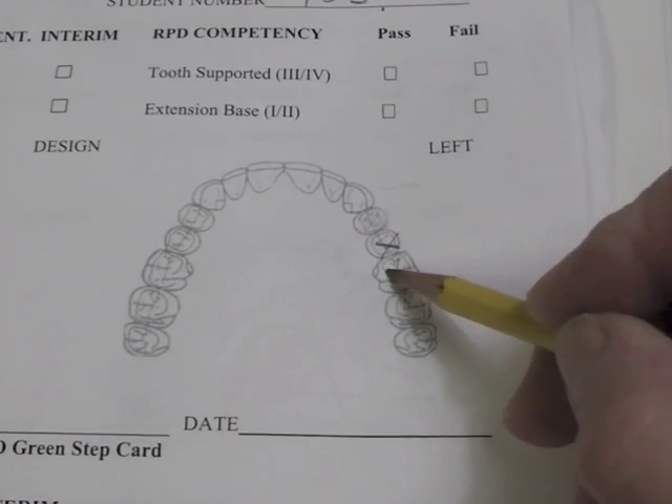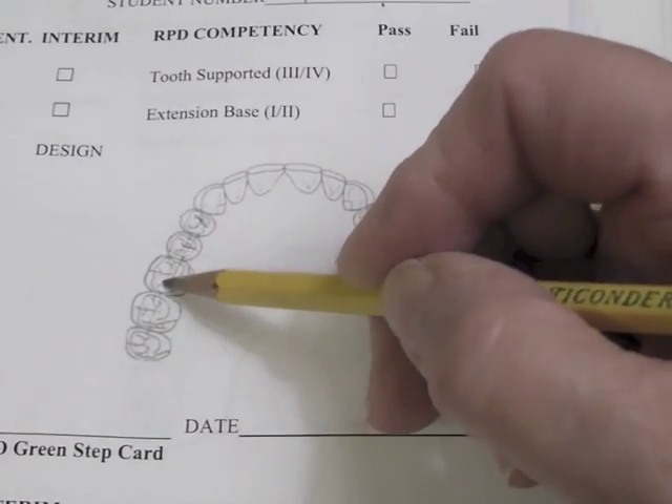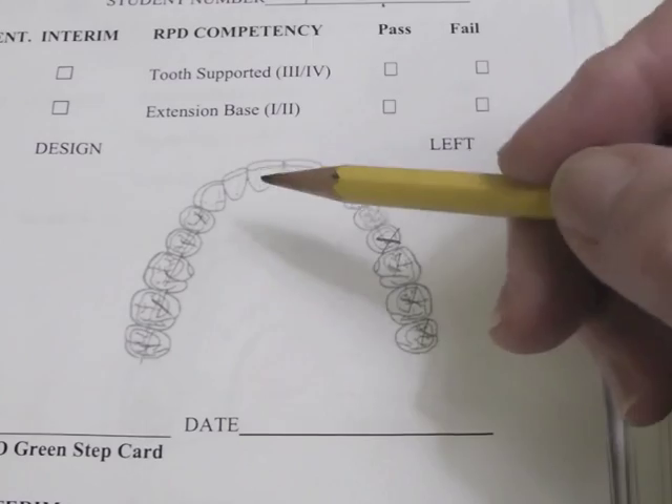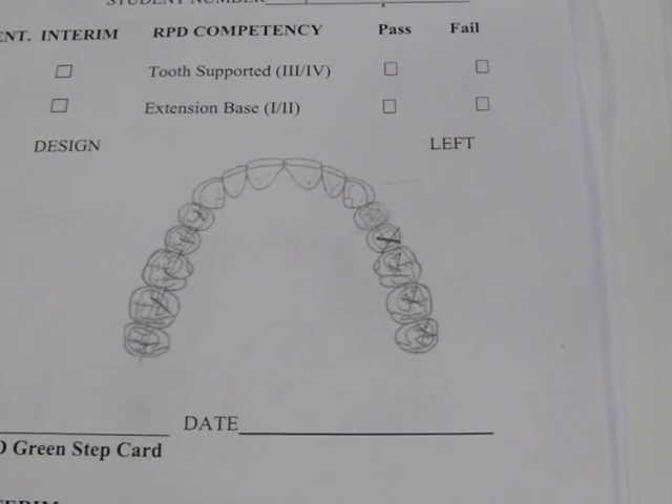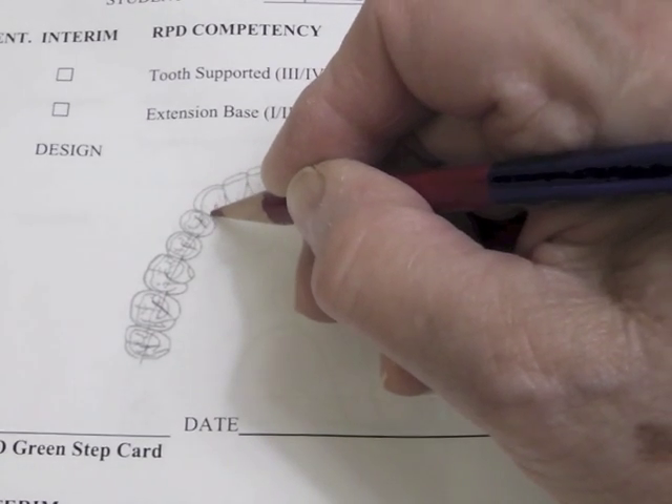First I'm going to cross off all the teeth that are missing on my cast, which would be all my premolars and molars on this side all the way up to the canine. When I draw my design, I'm going to start with my clasp assemblies.